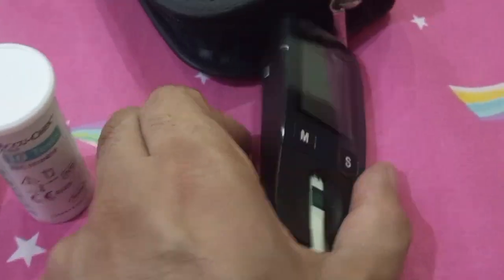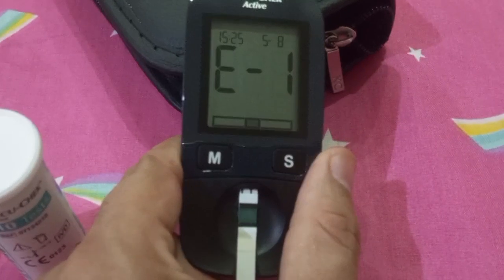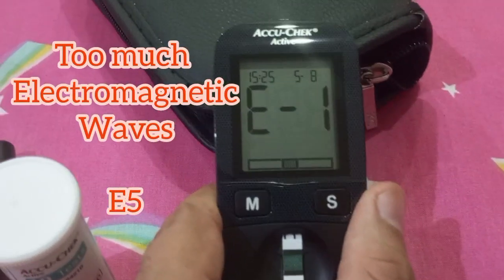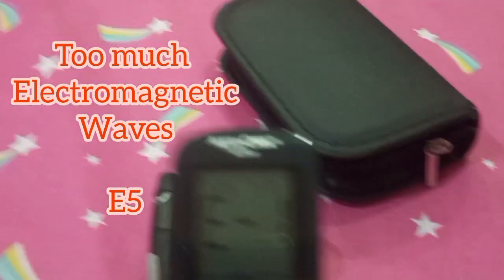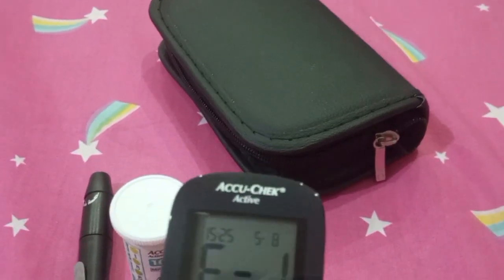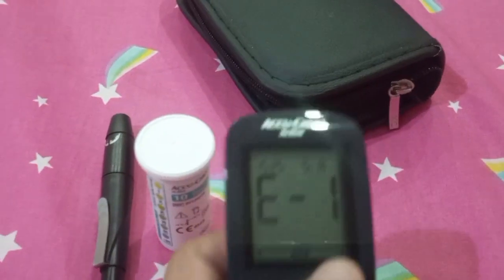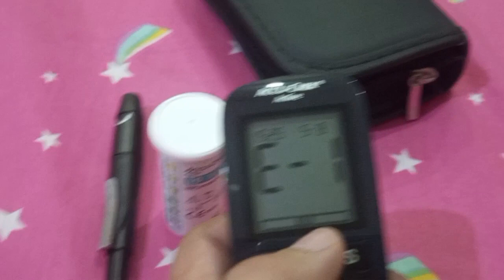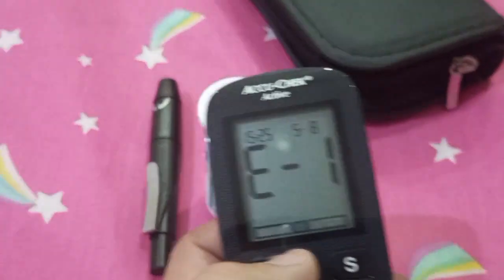Error E5 means there are too many signals from Wi-Fi or a cellular network around you, which is interfering with the circuitry of this device. Just change your position. To summarize: E4 is about USB connection issues, and E5 can be about cellular or Wi-Fi signal interference.